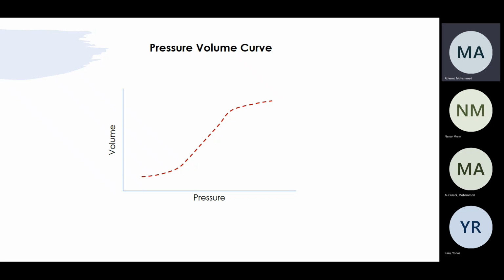Good. So that's why we always need to choose the appropriate PEEP for the individual patient. That's right. And the other thing is that we use PEEP to look at our compliance.